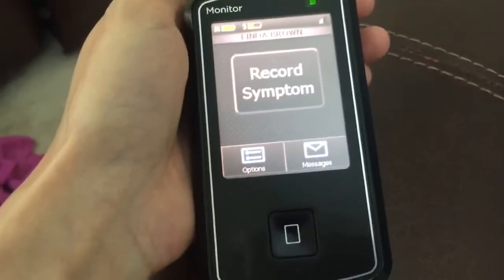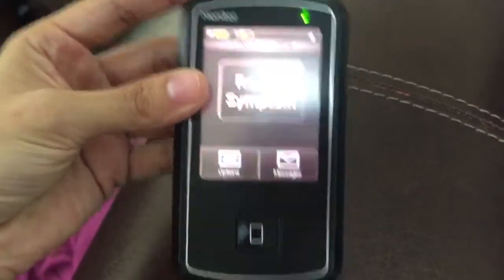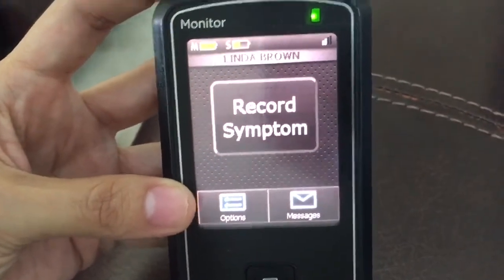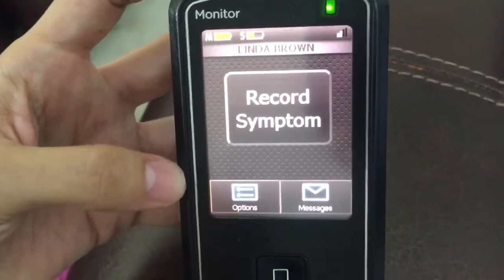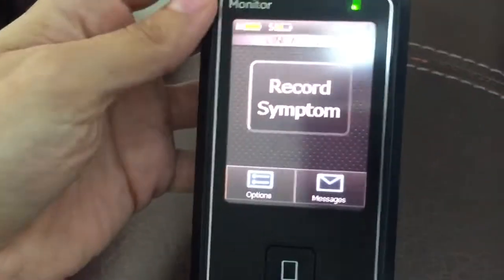This device also actually sends my heart waves directly to my cardiologist. Almost forgot to mention — with this little device I can record any symptoms I might have. For example, if I feel palpitations or shortness of breath, I just record my symptom.